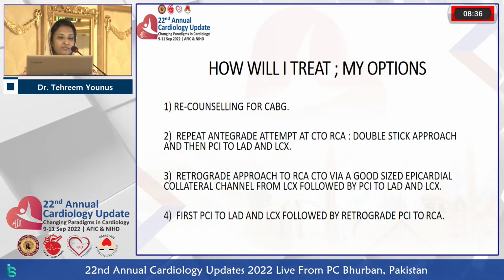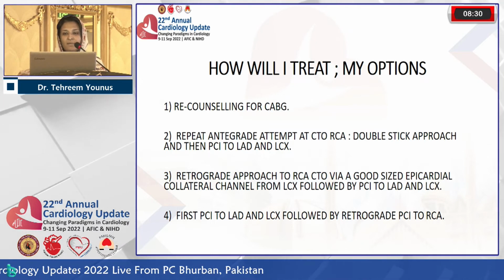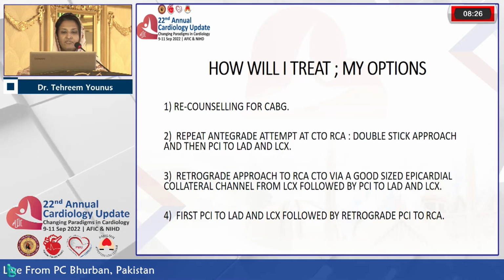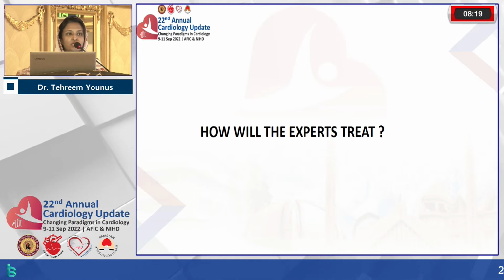Another option was the retrograde approach to RCA CTO via good size epicardial collateral vessels that were coming from the circ, and then followed by PCI to LAD and circ, and lastly, first PCI to LAD and circ, followed by retrograde PCI to RCA. So I'm sure experts will also have an opinion.